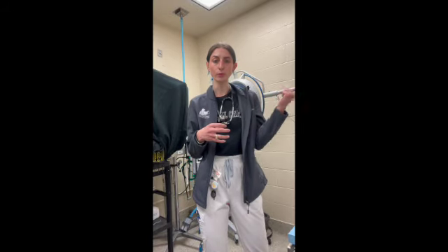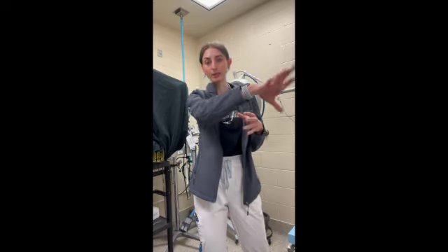But it's just going to be a shorter circuit that's going to have one end that is connected to the patient's endotracheal tube, and the other is going to have a reservoir bag connected. You're going to have a line that's going to connect to your oxygen source, and then an additional line that's going to connect directly to your scavenging.